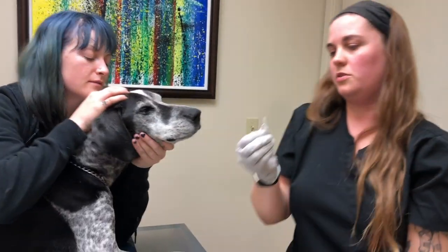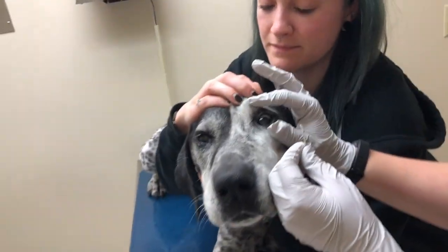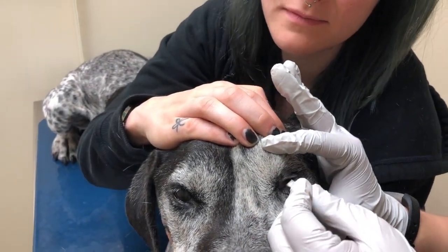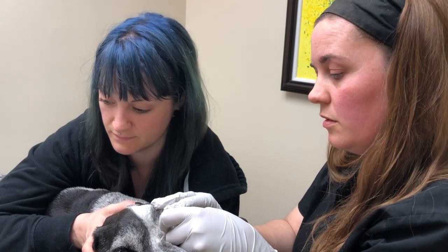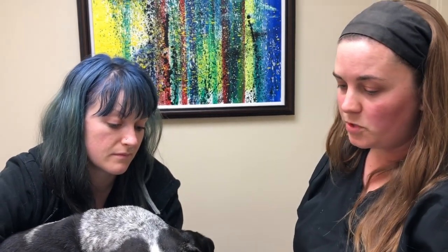So I'm going to take my strip with our bend. So after a minute on this side, we're at the 10 millimeters of wetness per minute, which is a little low, so we talk to the doctor if they want to start any treatment for it.